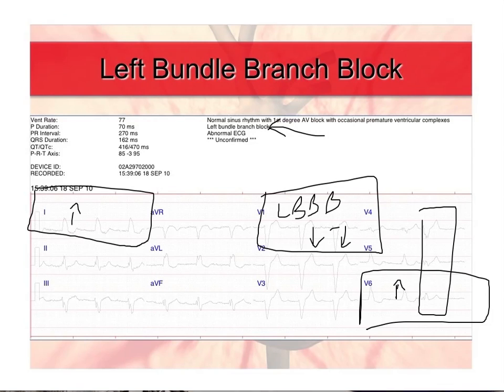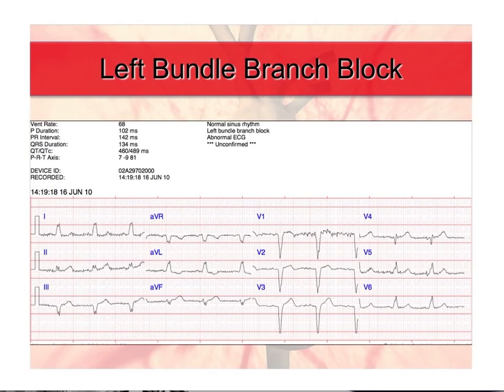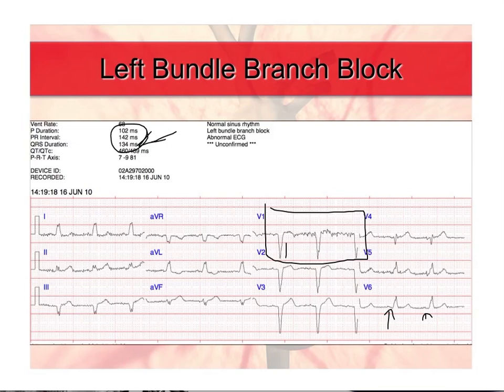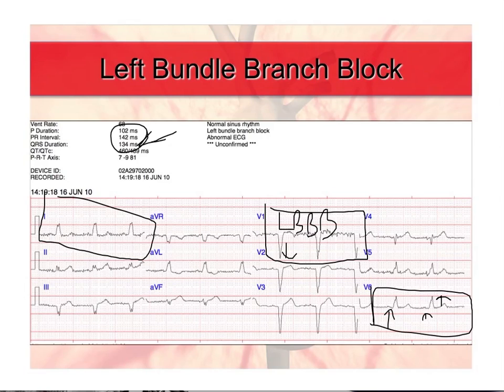The GE Marquette Interpretive Algorithm has identified it as a left bundle branch block as well. Looking at the next example — there's a little baseline artifact, but we can still identify it. It's wide at 134 milliseconds. Is it supraventricular? We do have P waves, just harder to see — the monitor sees them and calls it a sinus rhythm. Looking at V1, the last wave is negative, indicating a left bundle branch block. Looking at leads 1 and V6, we see upright monophasic R waves. This is a left bundle branch block pattern.